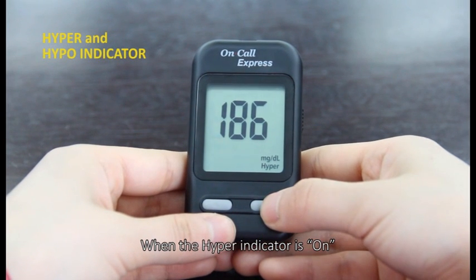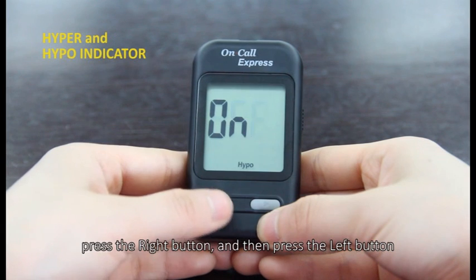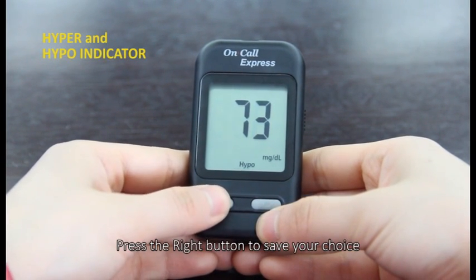When the hyper indicator is on, press the right button and then press the left button to adjust the indicator level. Press the right button to save your choice.